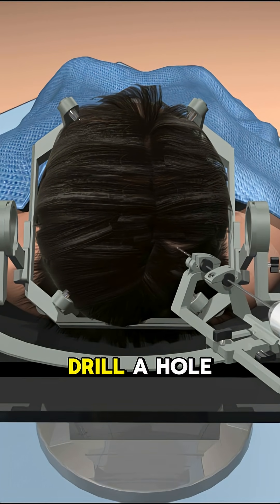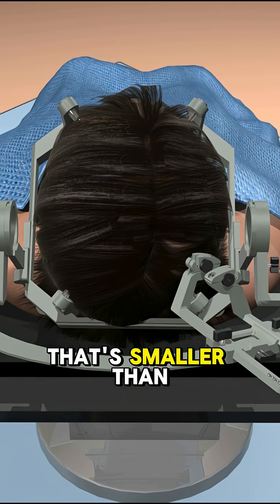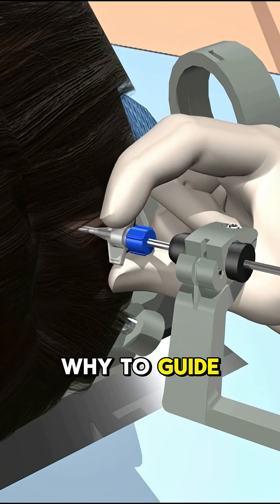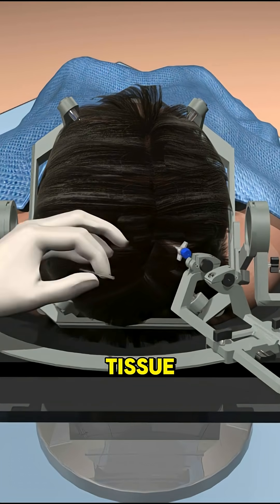Then they part your hair and drill a hole just 3.2mm wide — that's smaller than a coffee stirrer. Into that they screw in a bone anchor to guide the laser straight into the problem area without touching healthy tissue.